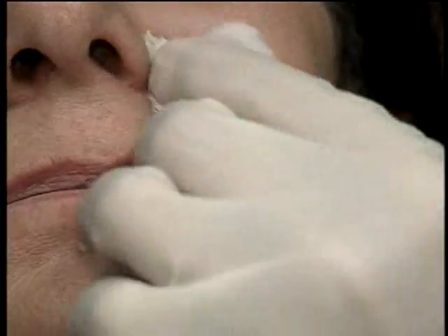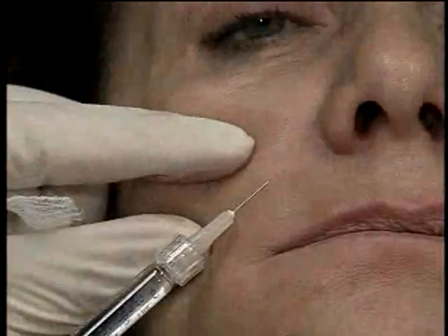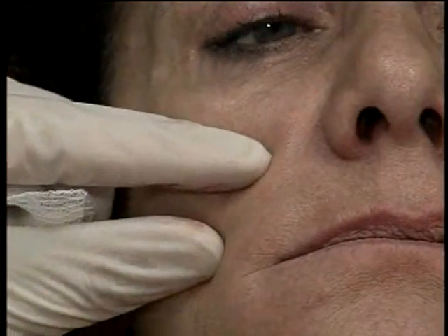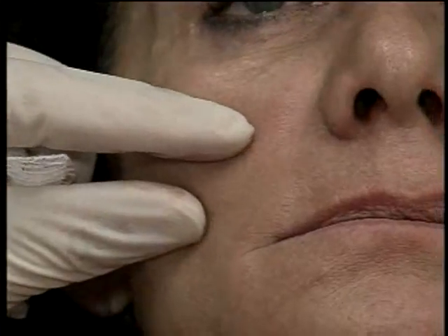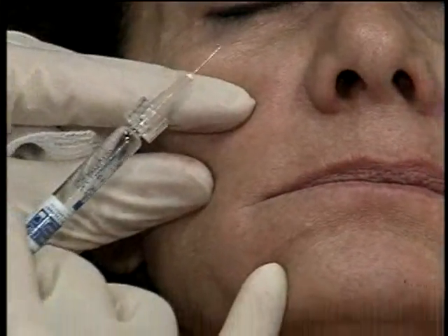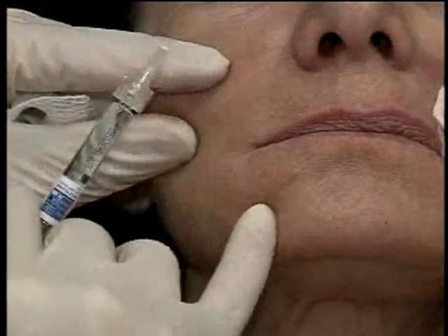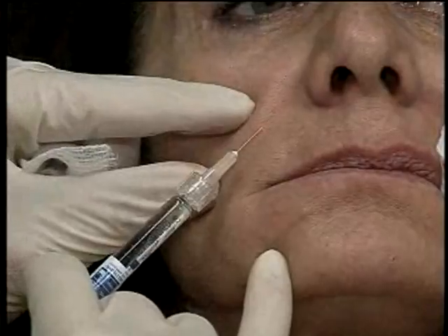Okay, so that side's filled. So you see my hand is here, and I see the fold. This helps me to see the fold, and I can go back and forth to see the fold. My pinky finger is on the patient. That way if the patient moves, my needle moves with her, and I won't inadvertently inject her.